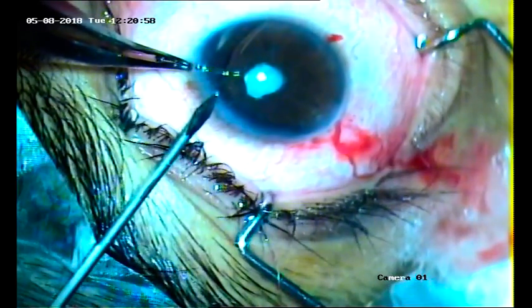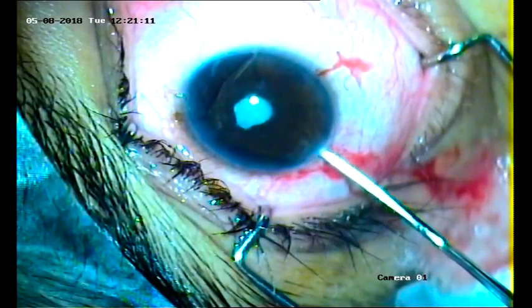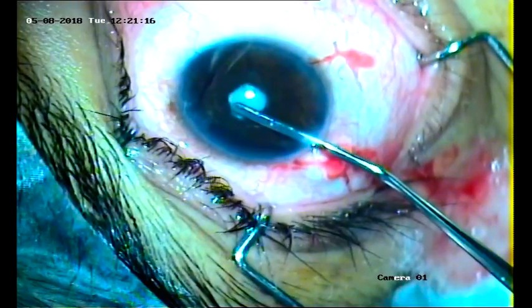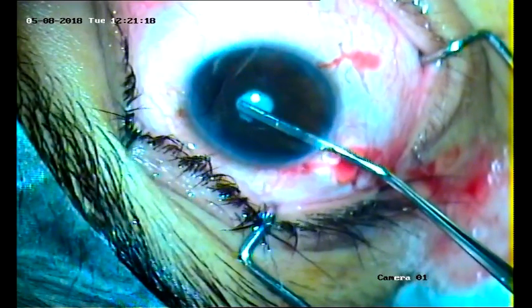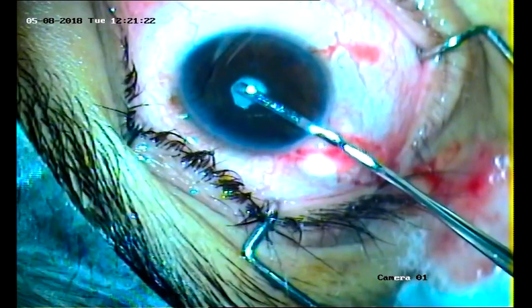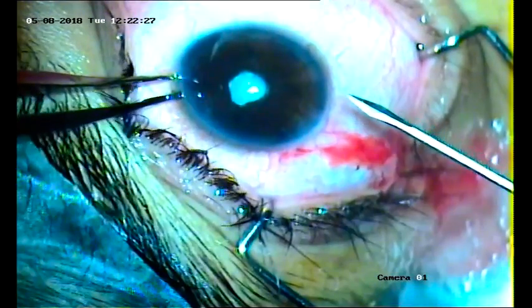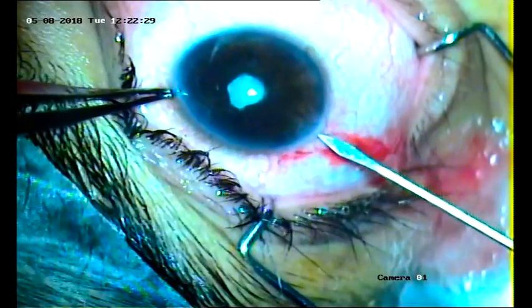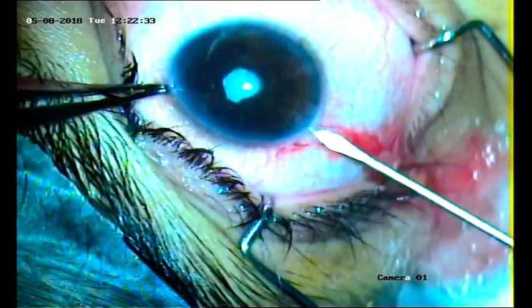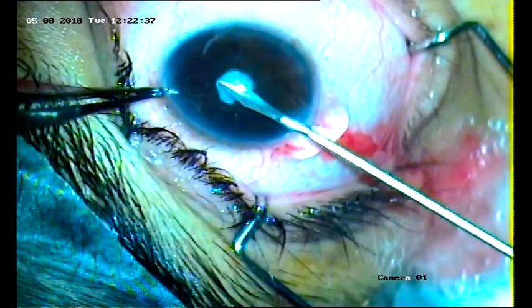As you know, the pupil is not well dilated in cases of uveitic cataract — it is a seclusion pupillae. The patient is a young male of around 40 years old, having ankylosing spondylitis, recurrent uveitis, vitritis, leading to complicated cataract. The patient had one episode of acute glaucoma and YAG iridotomy was done.